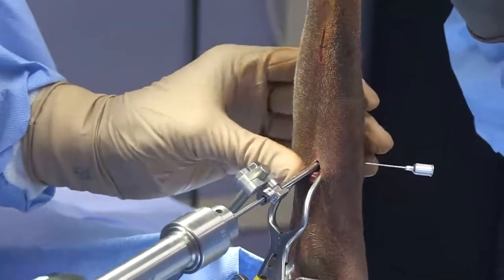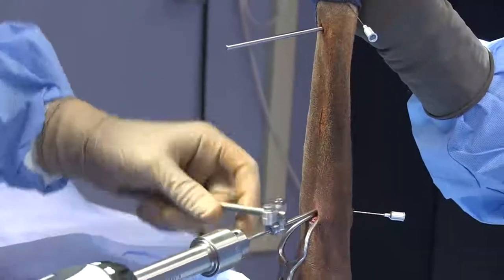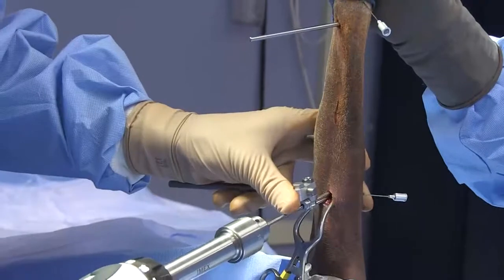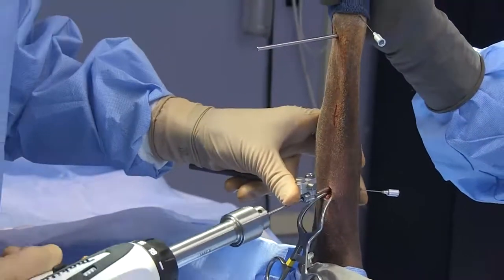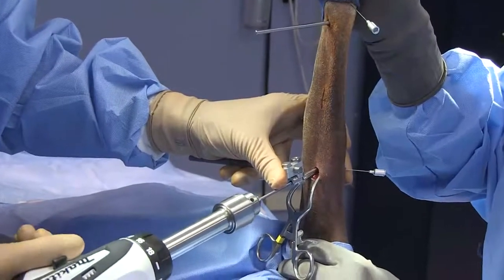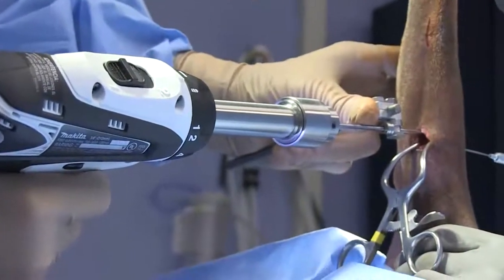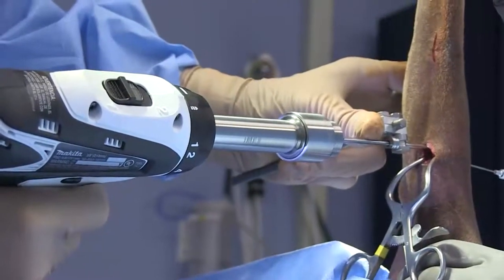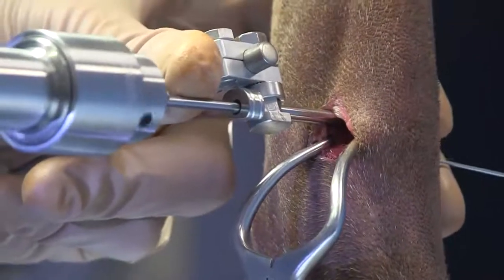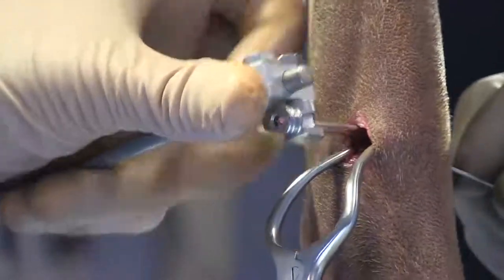Cranial medial is the plane we're aiming for. I've got my distal pin site here, so I want to have it angled in about the same direction. The drill sleeve is down against the bone and we can begin drilling. This can be a site, especially in a smaller dog, where you might slip off the bone because there is a curvature to it — if that happens, just reposition your drill bit and try again. We're through the opposite cortex — go ahead and get the drill bit out.